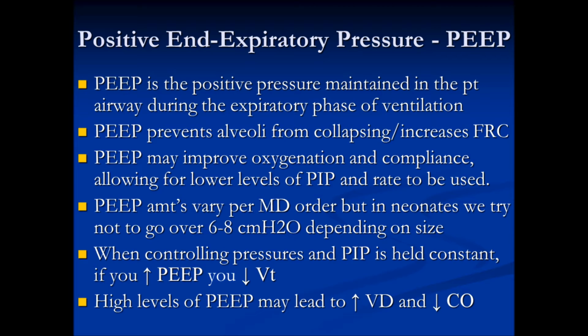But if nothing else changed, but you increased your level of PEEP, immediately the change in this cardiovascular system would be a decrease in cardiac output.